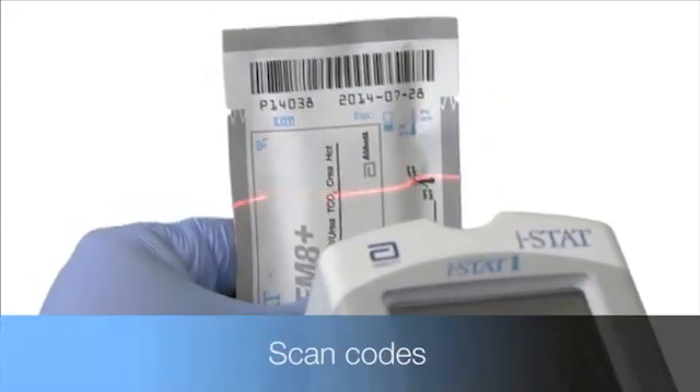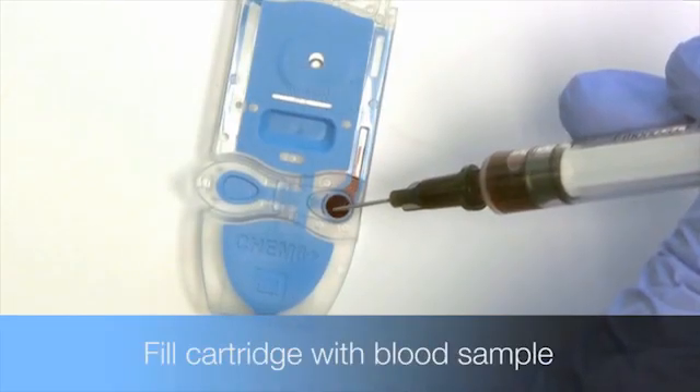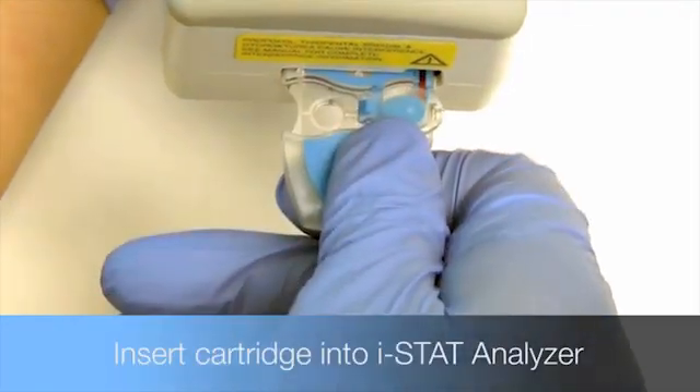First, scan the operator, patient, and iStat cartridge lot number codes. Next, fill the cartridge with fresh whole blood. Finally, insert the cartridge into the handheld.